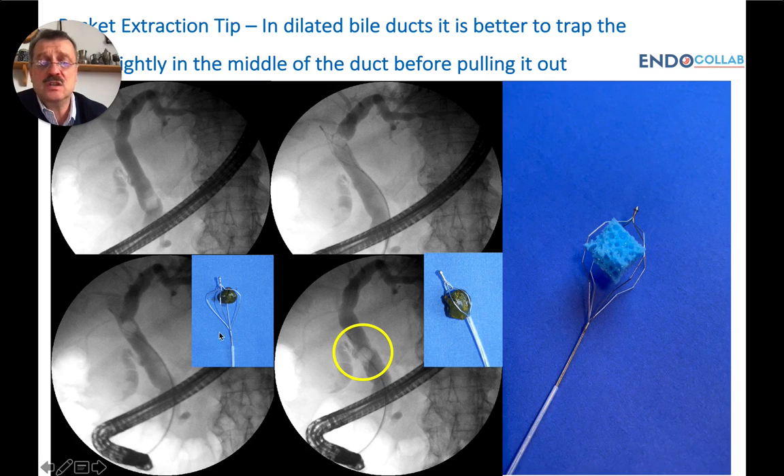Essentially, you open your basket like you were going to filter or sieve, pull the stone to the center of the bile duct, and then close it. Otherwise, if you start to close the basket proximally or inside the bile ducts, you risk the stone moving more proximally and then you have a problem grasping it.